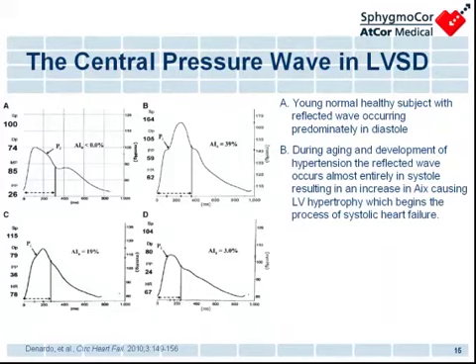They not only have more peripheral blood pressure problems, but the central pressure goes up. And you can see the bump and the rise after the bump. The augmentation index goes from 0, there is no bump, to almost 40%. A very high number for augmentation index. This is going to start causing LV hypertrophy, which is obviously going to lead to problems downstream.